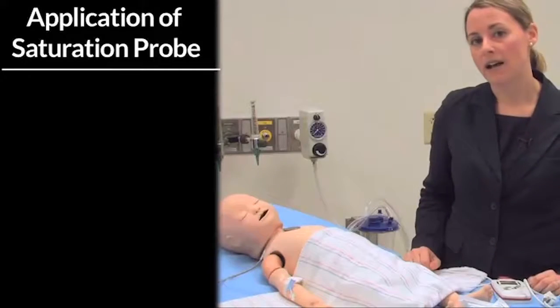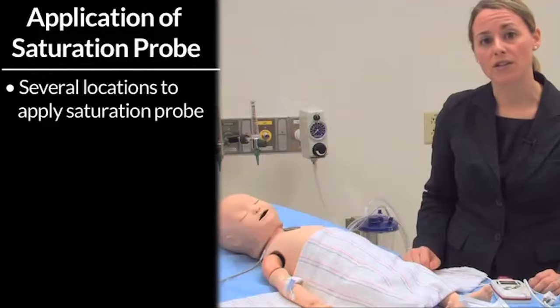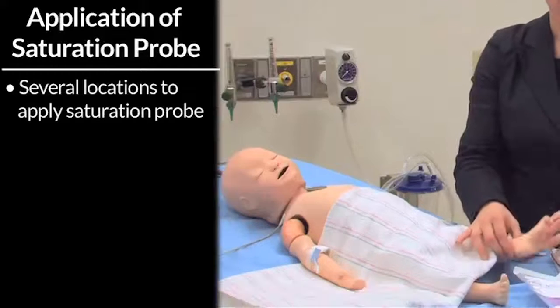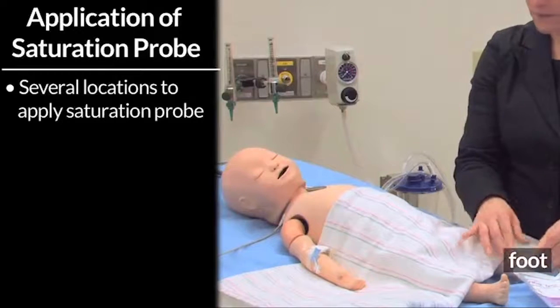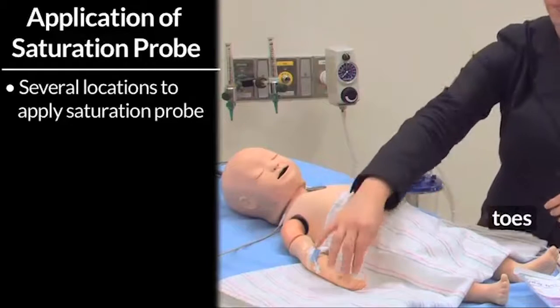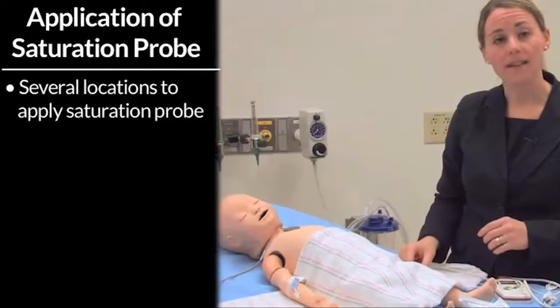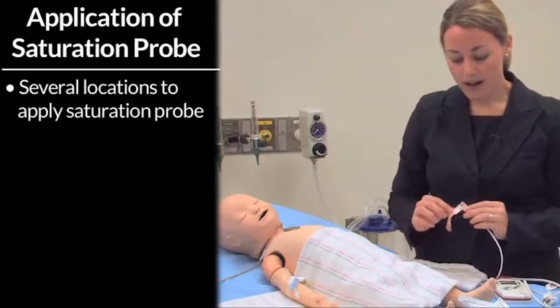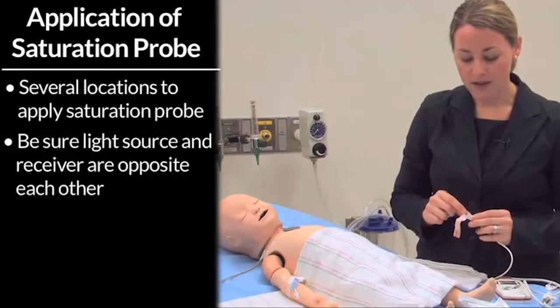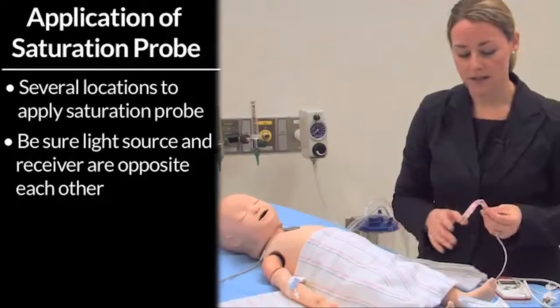When you go to apply your saturation probe to your patient, there are several locations that you will be able to use. In a small infant or child, you can often use the foot, the hand, toes, fingers, or even sometimes earlobes. The one thing that's most important to remember is that you must make sure that the light source and the receiver are opposite of each other, no matter where you place this.